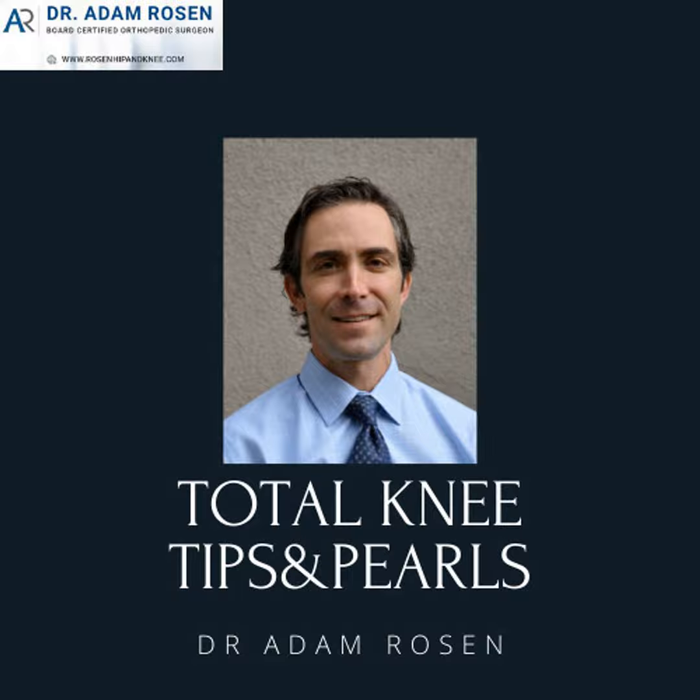You just want to be aware, especially if they have a very wide scar, that again, the soft tissue will allow you to close end to end at the end of the case. So once I've exposed and taken out the scar, then we're going to move on with the next few steps. So at this point, typically with a primary, it's quite easy to identify your extensor mechanism.